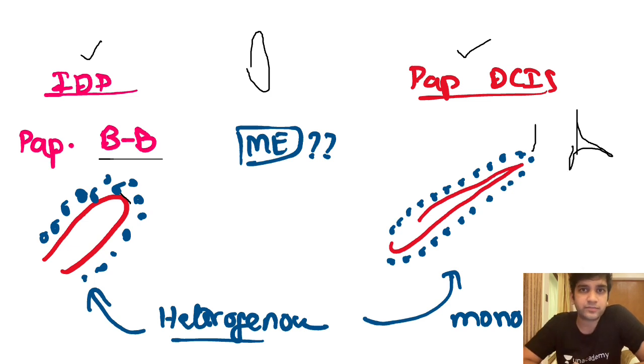It was like this. So when you have slender, tapering papillae, I generally think it is a neoplastic, malignant process, or at least on the side of malignancy, at least DCIS. When I have broad-based papillae, I'm comfortable calling it a papilloma. So by histomorphology I know how to differentiate them, right? I'm not saying I don't know. I know, but I'll apply markers still.